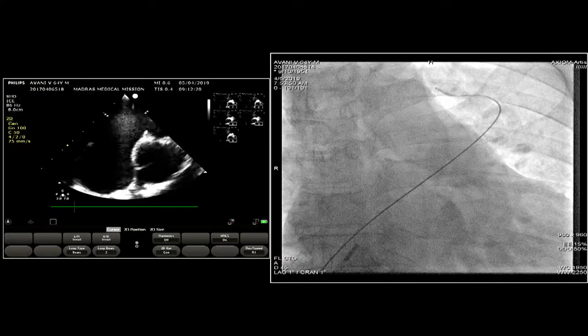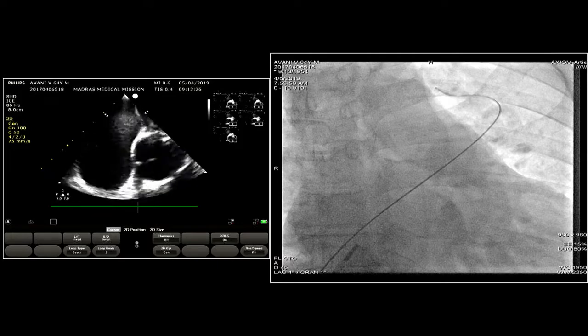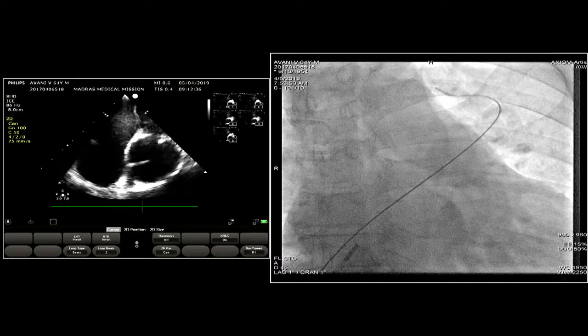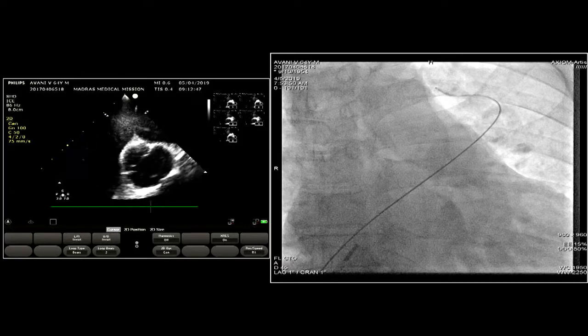Yeah. So in this patient, I'll again repeat the whole hemodynamics. The right atrial and the left atrial pressures were around 8 mean. The pulmonary artery pressure was around 50, 54? Yes, 55, sir. 55 systolic with a mean of 32, and a diastolic of around 20. So the QP/QS was 2.8 to 1. Yes, sir. What was the PVRI? PVR was 3.1. The PVRI was 3.1.